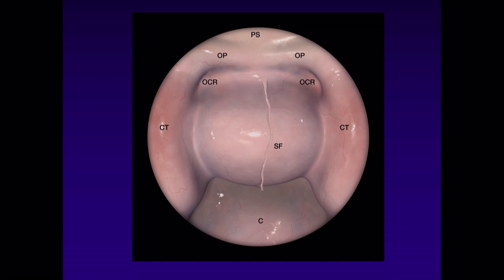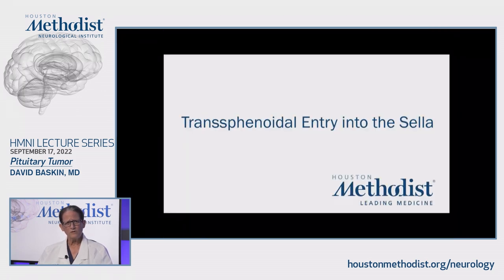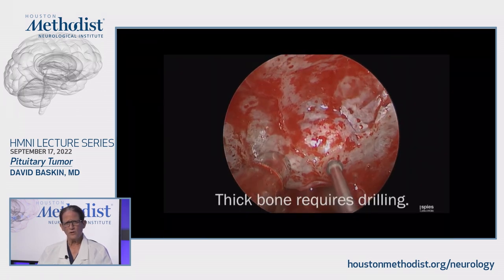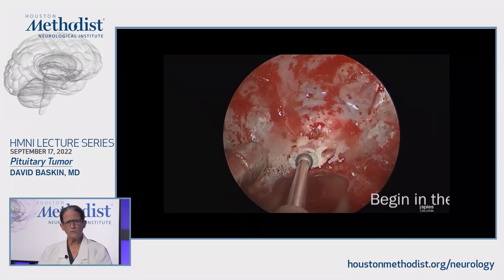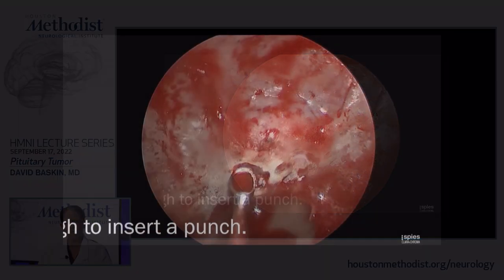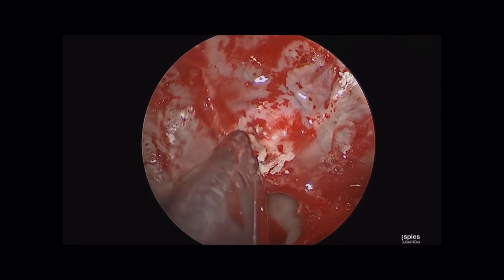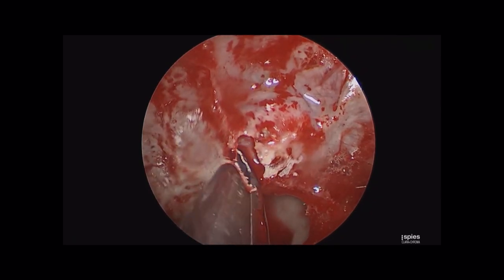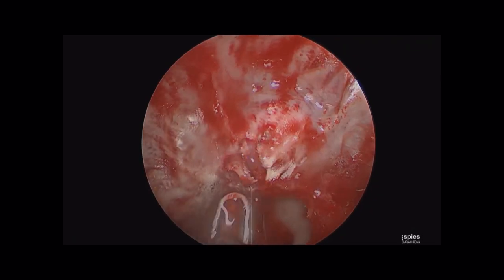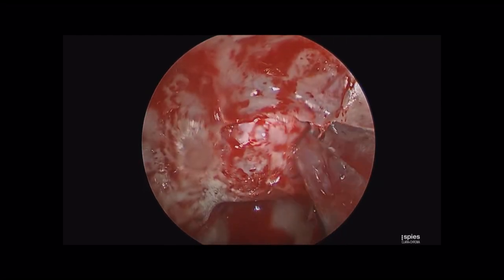One of the biggest mistakes in transsphenoidal surgery is people don't make a full exposure, and then they get off track and get into misadventures. Here's a video showing entry into the sella. I've been through the nose, and I'm now going to drill the sellar floor using a high-speed diamond burr. I define an epidural plane, then use a punch to open the sellar floor. With big tumors the floor is usually very thin; sometimes it's thick and you have to drill more, but usually you don't.